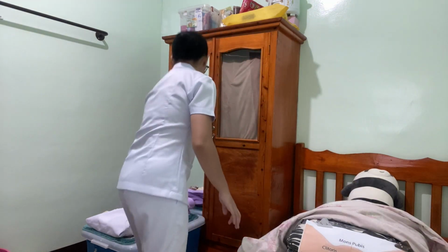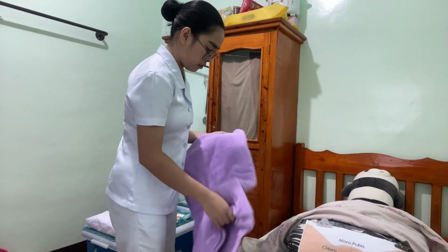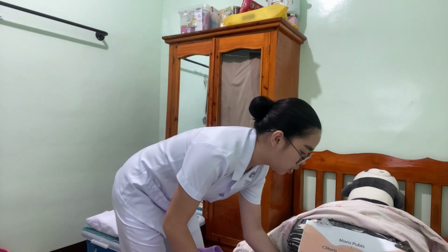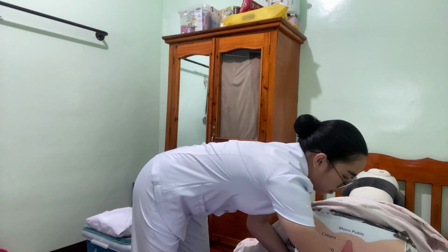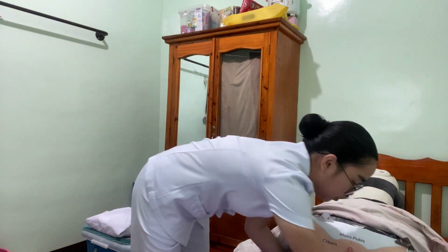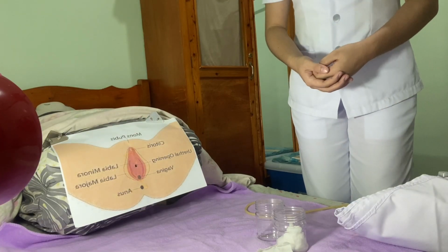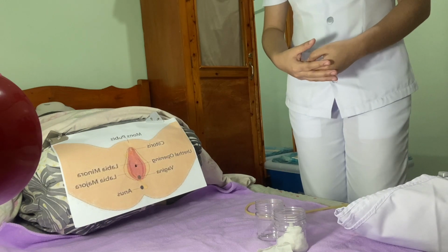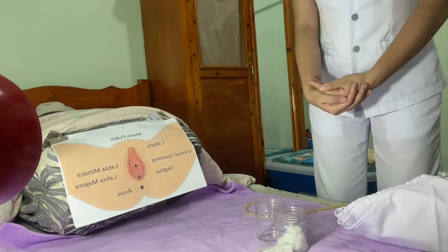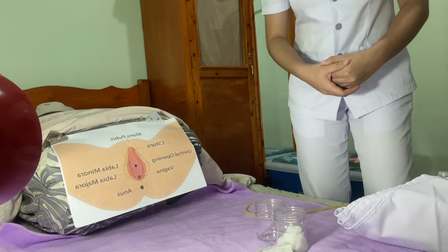Okay, so I'm gonna put this. So I'm gonna leave here. Put this one. Okay, so I had already provided a direct line for visualization of the genital area, and also I have already opened the tray and arranged the equipment for the convenience and to avoid contamination of the sterile items.